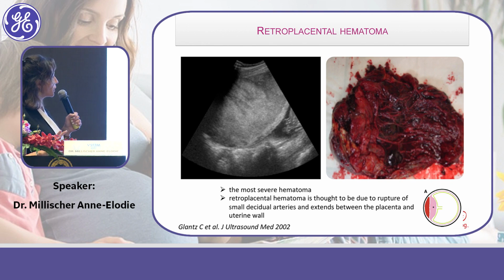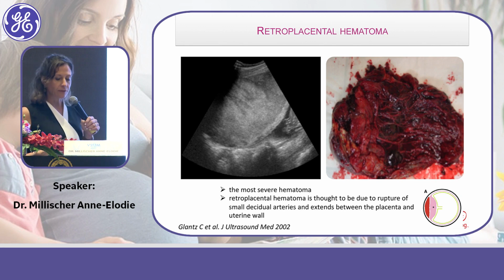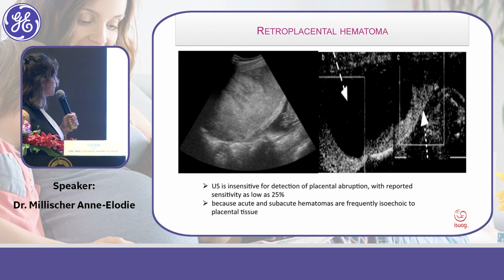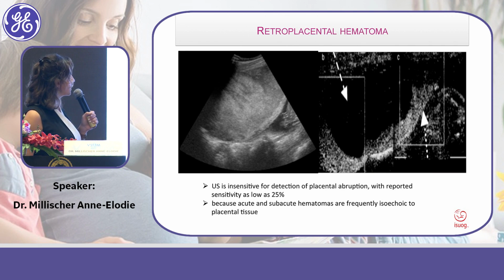Which is not just an invasion of the placenta, but a mass, an aspect of mass inside the placenta, as you can see here, with little cysts.